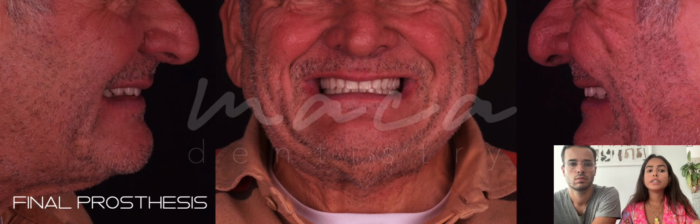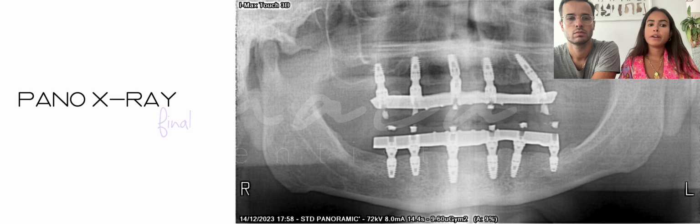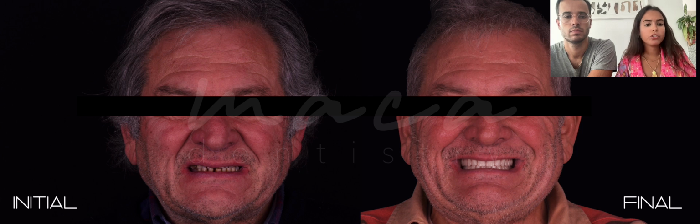And finally, we delivered in the upper arch a full arch screw-retained fixed prosthesis over multi-unit abutments, and in the lower arch a full arch screw-retained fixed prosthesis over OMNI system abutments. And this is the final extraoral situation. These are the final intraoral pictures, and here you can see the final panoramic X-ray confirming the proper fit of our final prosthesis. Finally, we can appreciate the comparison between initial and final situation of the patient.